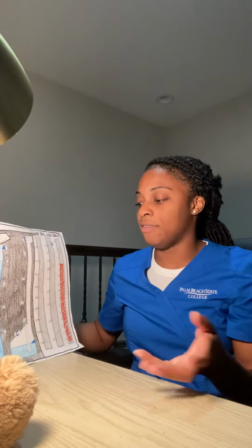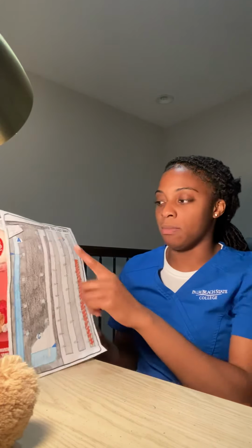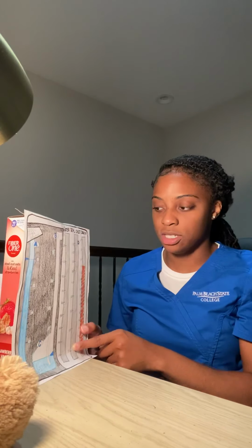So once I've done that, I'm assessing the lung sounds and the heart sounds to see if there's anything abnormal. And my patient sounds pretty normal, with them being on a chest tube. So I've done those assessments. So now I'm going to monitor my chest tube.